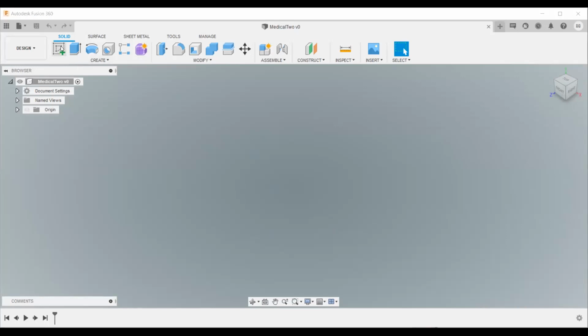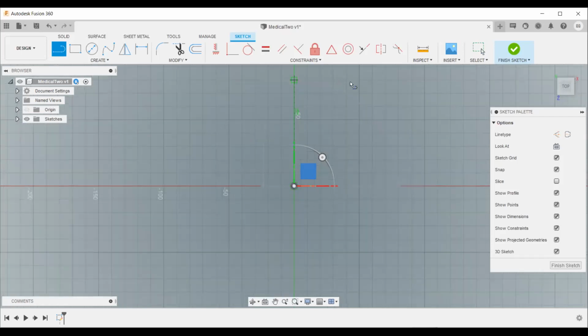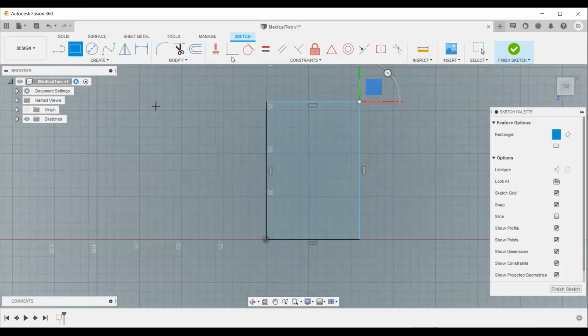Okay, let's continue. I want you to start a new sketch on the top. Everyone, start a new sketch. Then we are going to use a line. We want to draw something very simple, a simple device. You can decide to do this or use a rectangle. Rectangle is very simple to use. So just start with a rectangle.